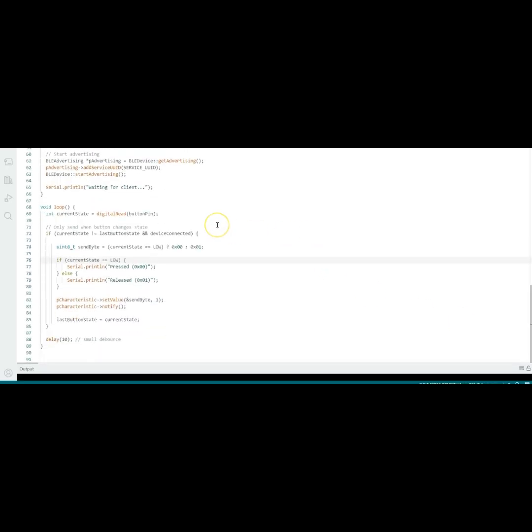In the loop, we read the current state of the push button. If it's pressed, we send the information to the phone. If it's not pressed, we also send that to the phone, and then we update it. And then here we include a small delay. This code is for our second ESP32, which is for the EMG test.